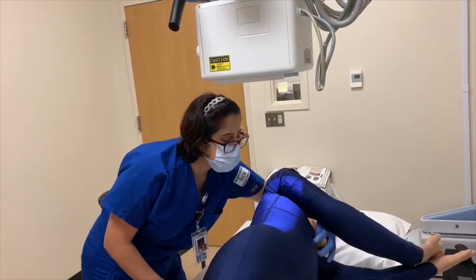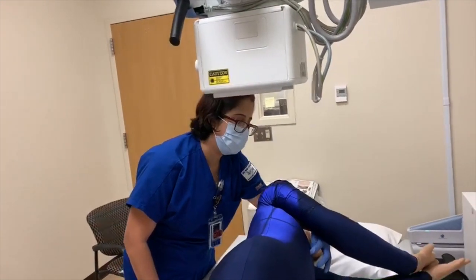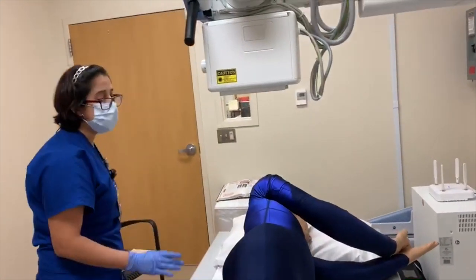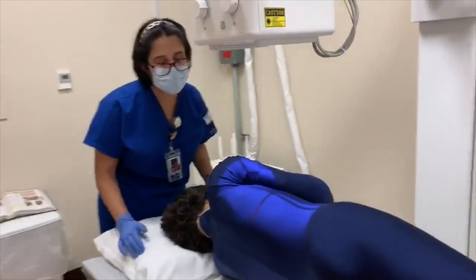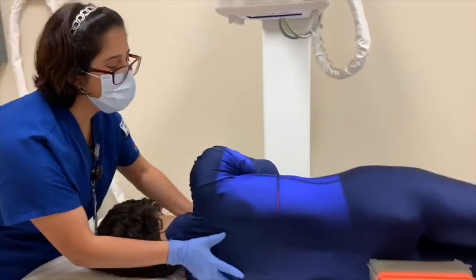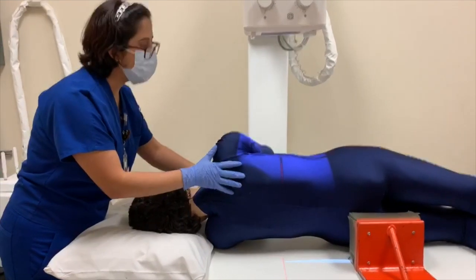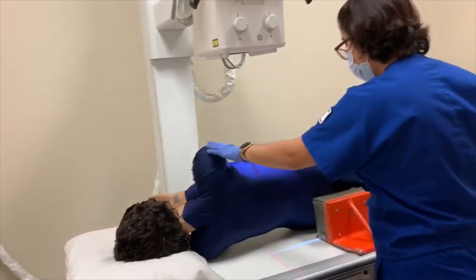I just need to come up a little bit. Okay, you want to make sure that you have your MSP aligned. Make sure that her shoulders aren't too rotated or under-rotated. So she's looking good there. Keep her arms like that.